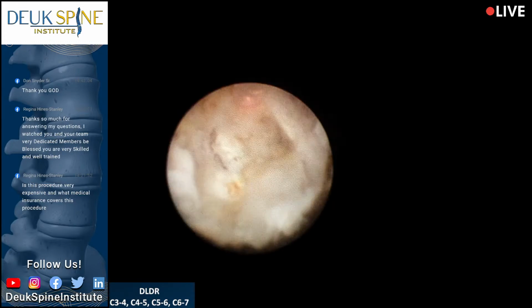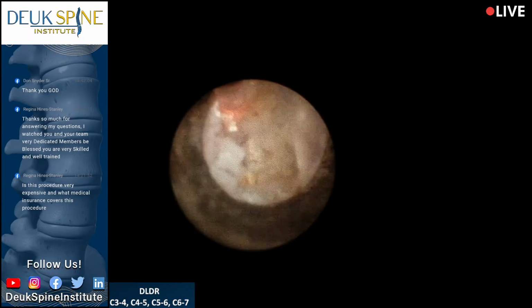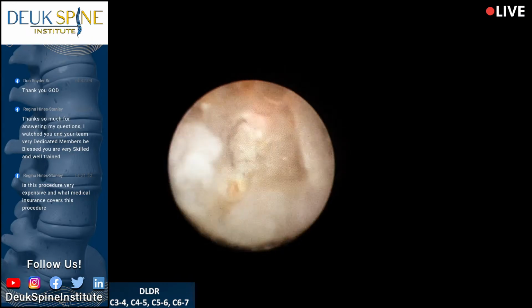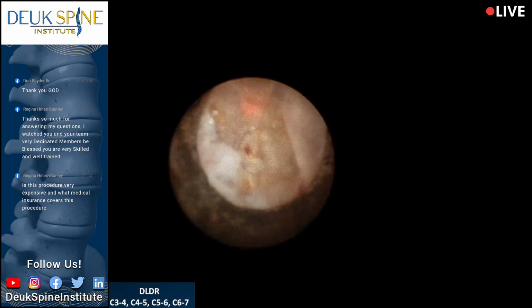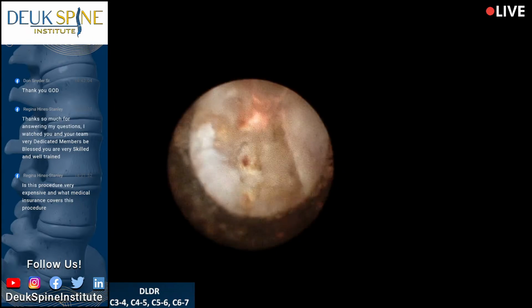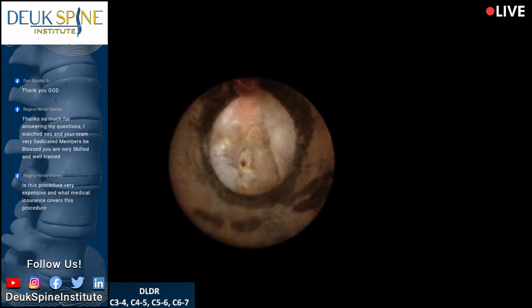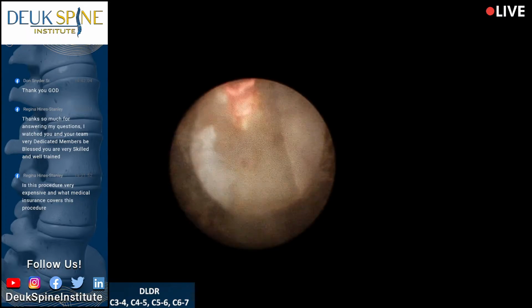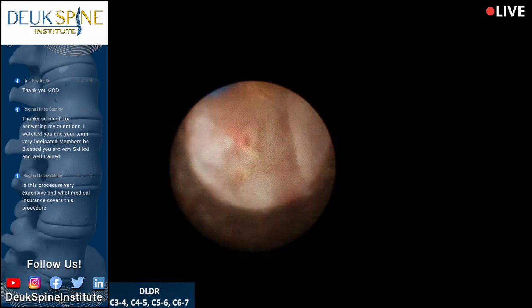We just got, you know, it was so challenging to get the tube in, I wasn't able to do the discogram properly. So we had to forfeit the discogram, but we got the big win instead. So we lost the touchdown, but we won the game. All right. This is all scar tissue here from chronic inflammation from the herniated discs.